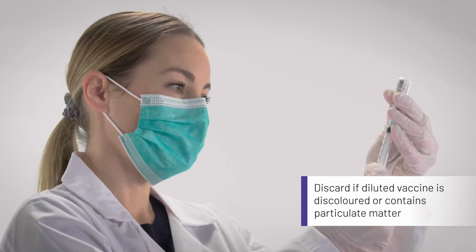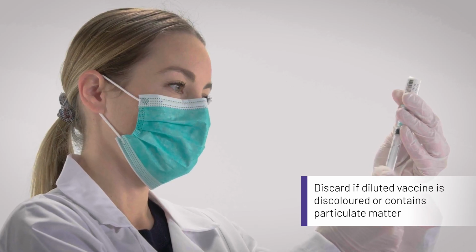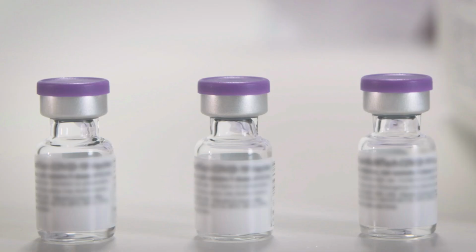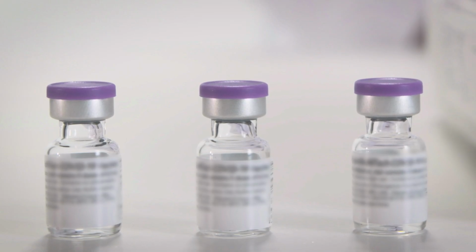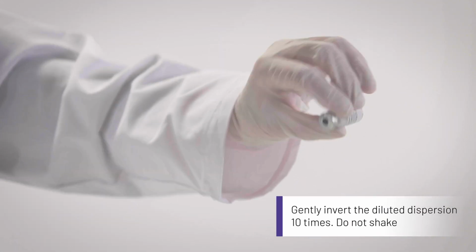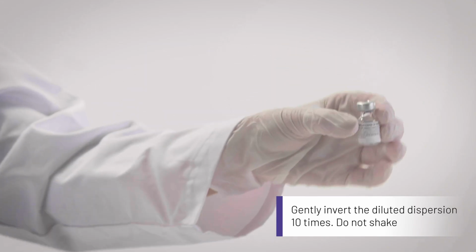The vial contains 2.25 milliliter, corresponding to 6 doses of 0.3 milliliter. Inspect vials to confirm there are no particulates and no discoloration is observed. Use a separate sterile needle and syringe for each individual. It is not necessary to change needles between drawing up the vaccine from a vial and injecting it into a recipient, unless the needle has been damaged or contaminated. Gently invert the diluted vial 10 times to mix. Do not shake. Dilution of the vaccine will result in an off-white dispersion.